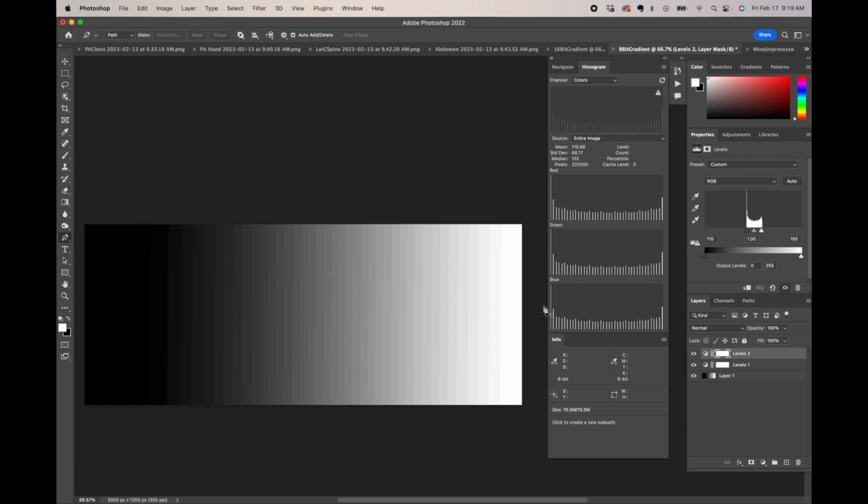The main thing is when the machine is automatically doing this adjustment for us, it's basically lying to us and saying, oh, your technique was great, when actually maybe it wasn't. Sometimes it just spits out the image and we don't see it making an adjustment. It may be fast enough to do that without us knowing.